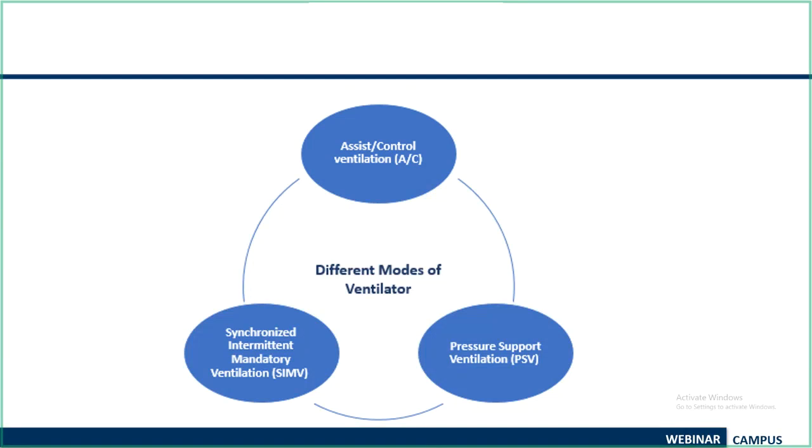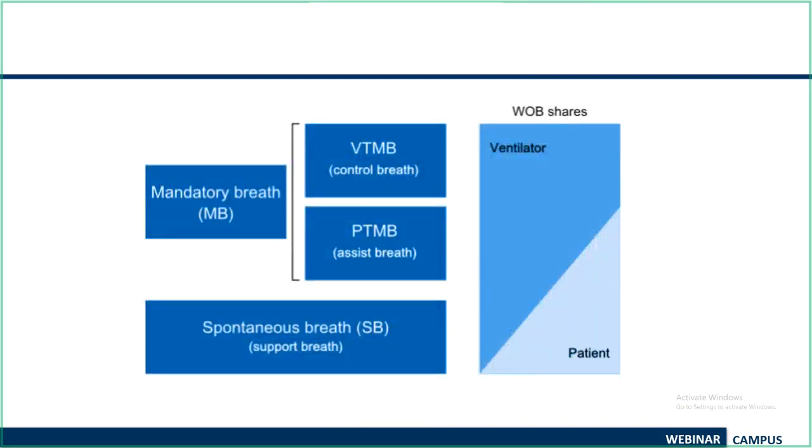We will explain what is control mode, what is assist control mode, all those things. And again, before going into the modes per se, we should understand what is a mandatory breath, what is a spontaneous breath, and what is the difference.